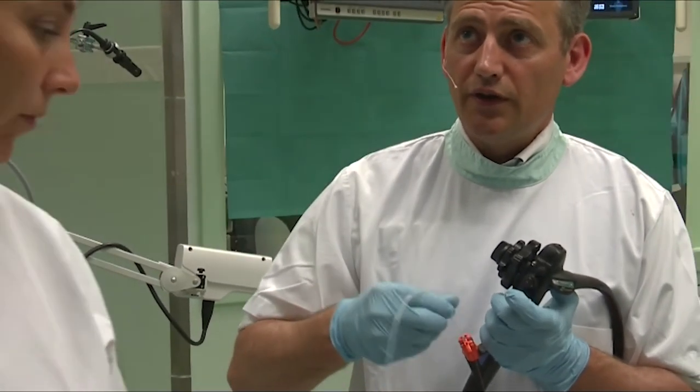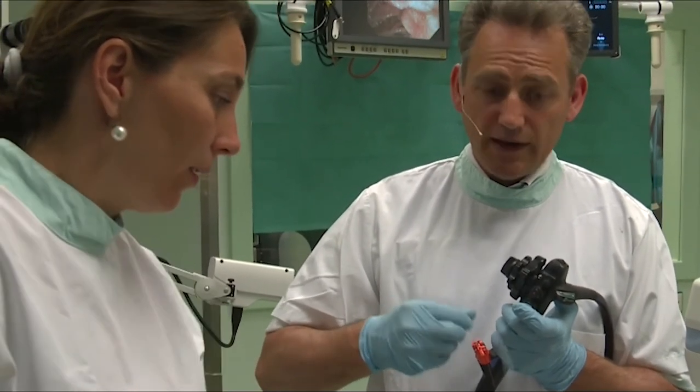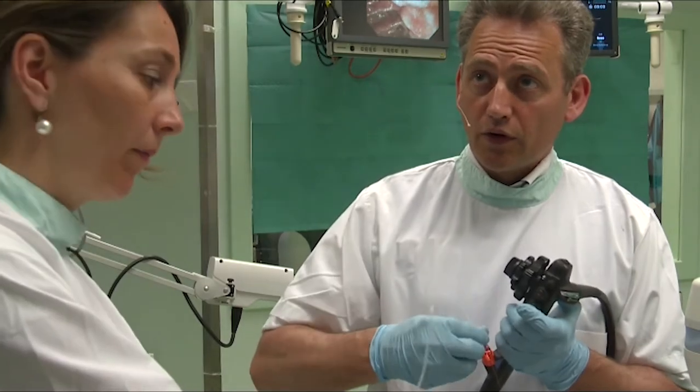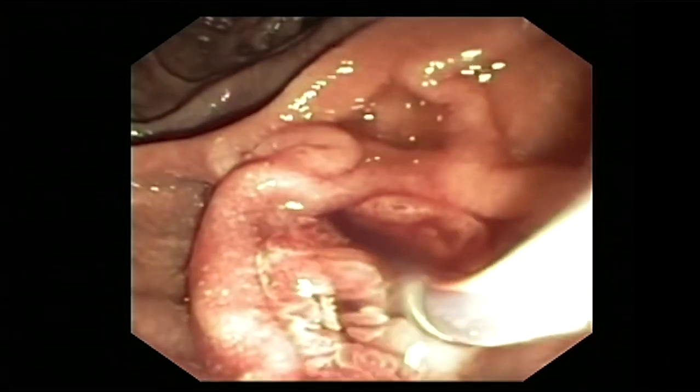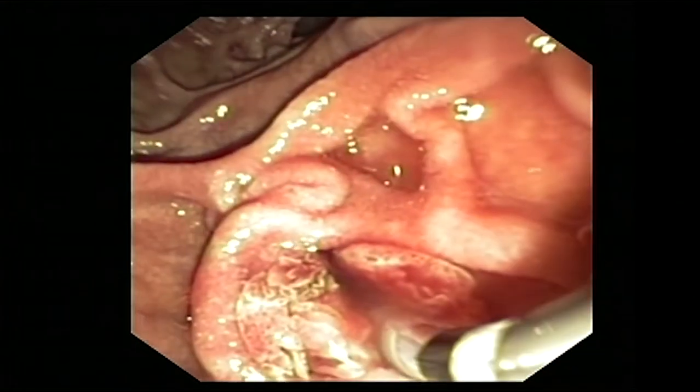Again, for introduction into the common bile duct, we will get into a short position, very close to the orifice. We will first introduce it into the upper portion of the common bile duct. The brush is out now, and I'm slowly now withdrawing the device, and I take a good look at the distal marker, which I withdraw up until the level of the ampulla, and now the brush is inside the stricture.